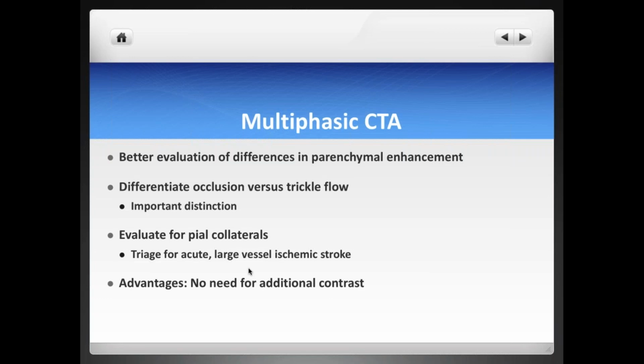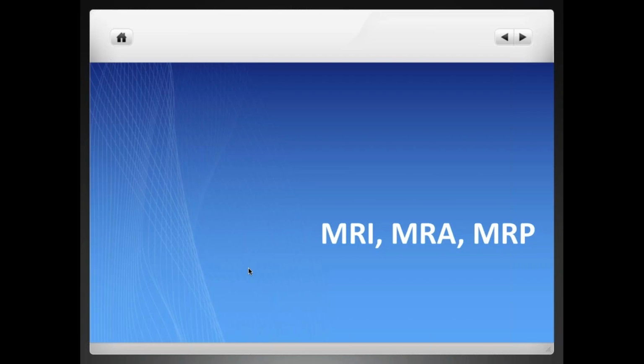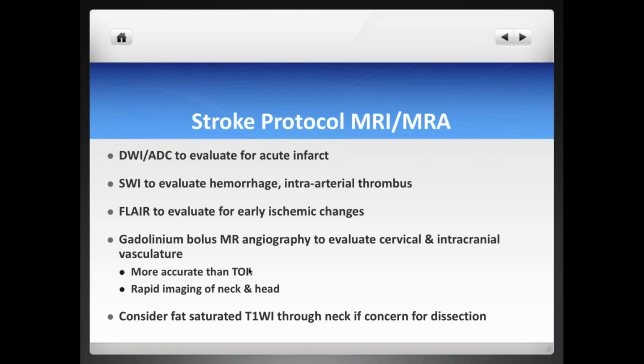But both modalities, multiphasic CTA and CT perfusion, are good, and I think it's just going to come down to personal preference. There hasn't been any study comparing both of them, but I think both of them are definitely useful, depending on which context you're practicing. Moving on from CT, I think we could move now to MRI and talk a little bit about MRI.